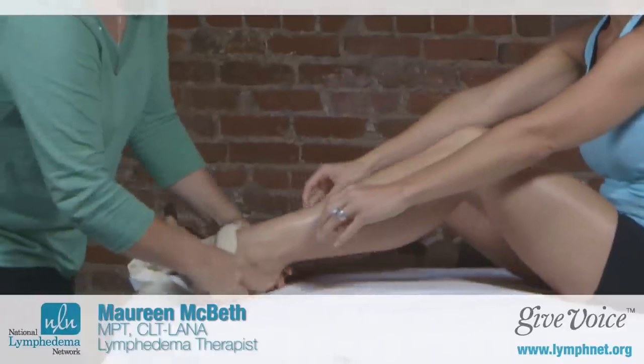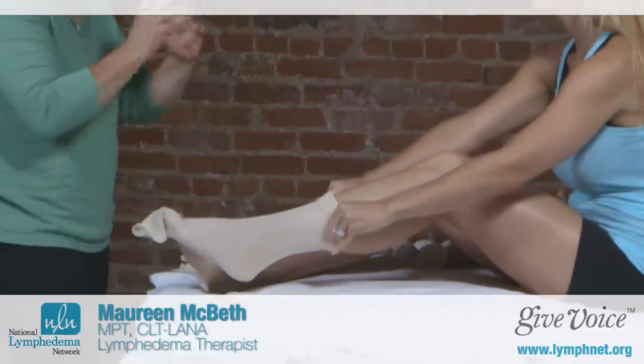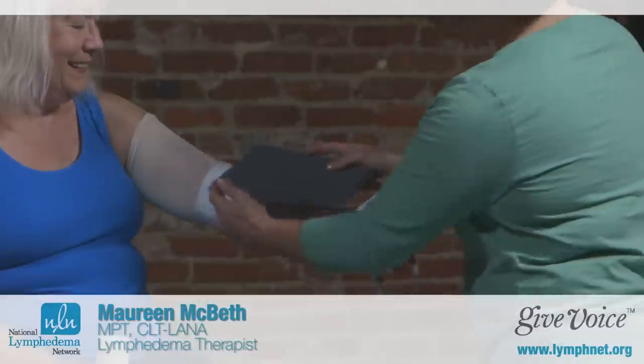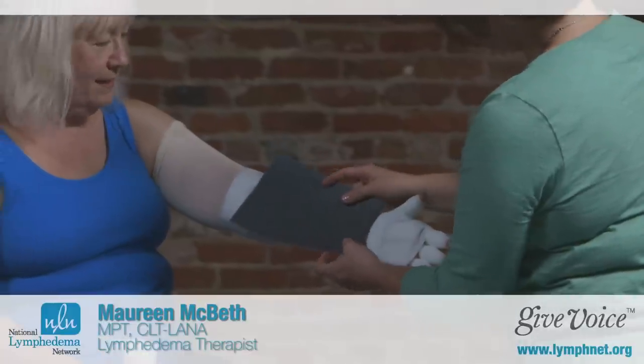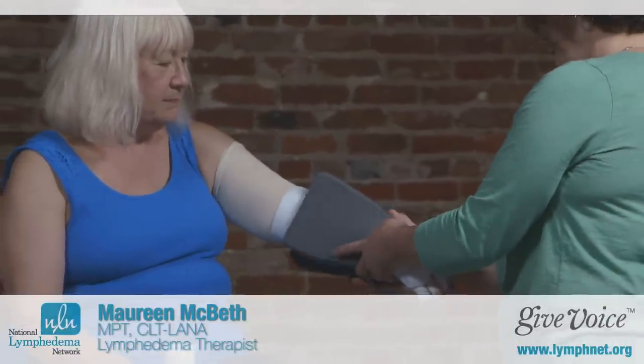Now let's talk about the layers of your bandage. The short stretch bandage, if applied over your skin, would be uncomfortable. So we start off by washing the skin, doing your skin care, and then some type of stockinette is worn, and that helps keep the rest of your bandage materials clean. We use different types of padding or foam to help make the bandages more comfortable to tolerate, and also help to provide support of the swollen tissues.